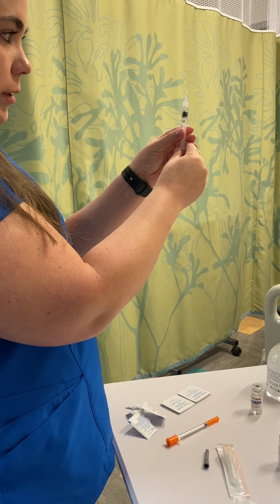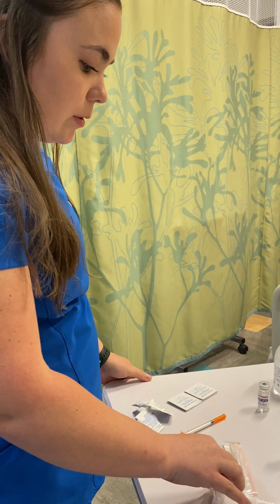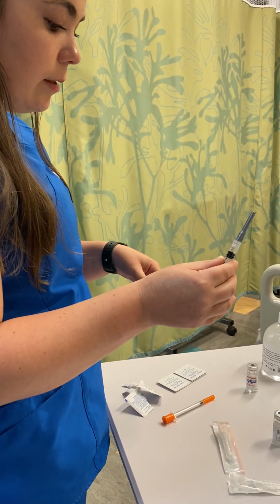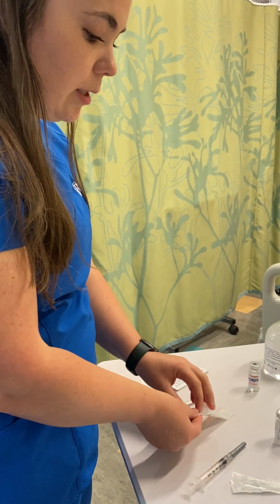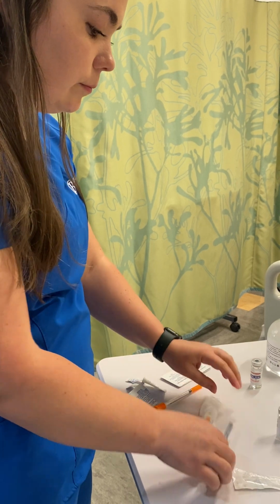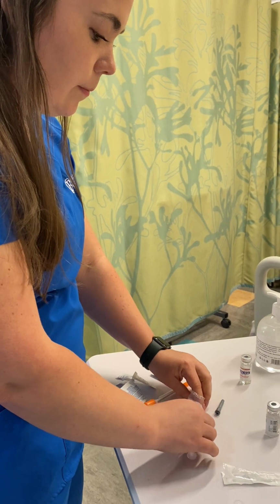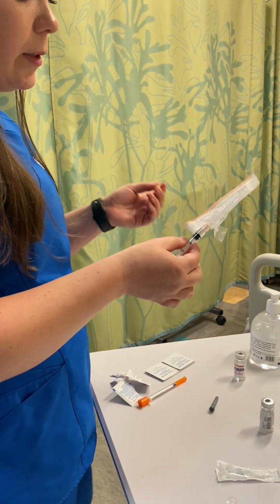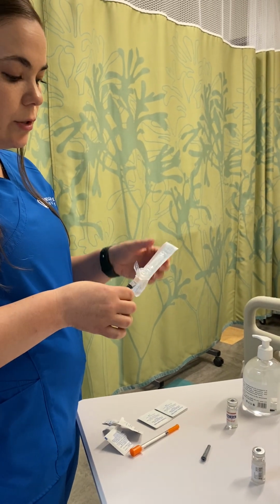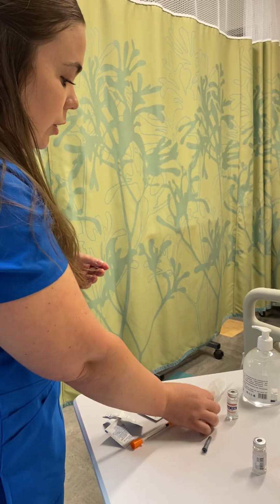And then waste according to facility policy till you get to the right amount of medication, and recap using the single hand method. And then I would switch my needles as indicated for administration. And I would label this with the concentration, the patient's initials, my initials, the date, the time, and what the medication is. This is our flu shot.